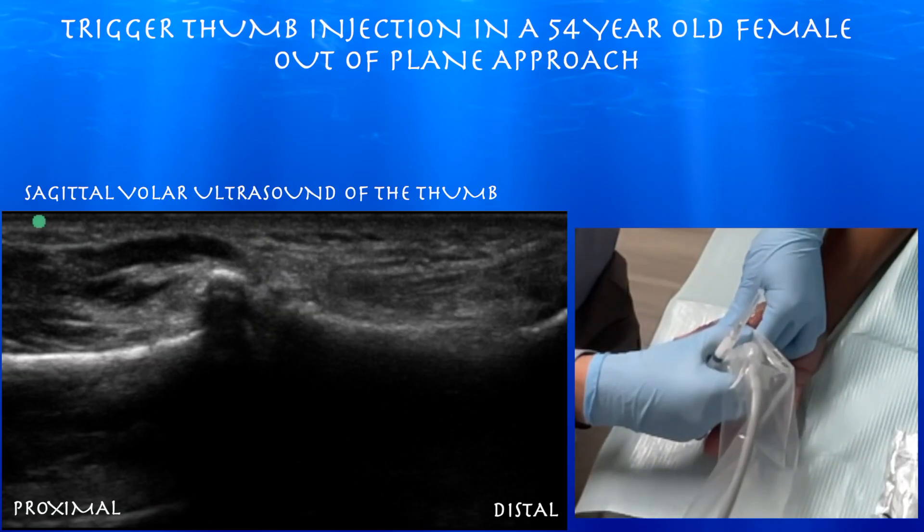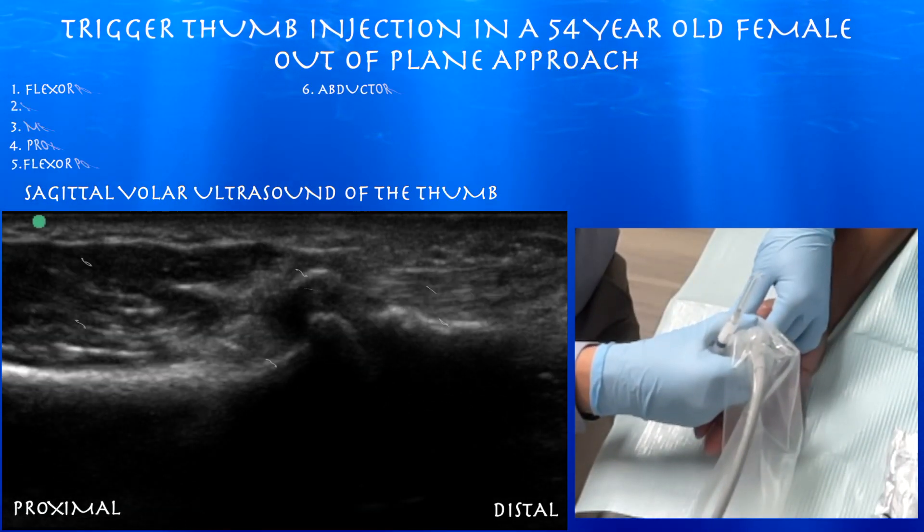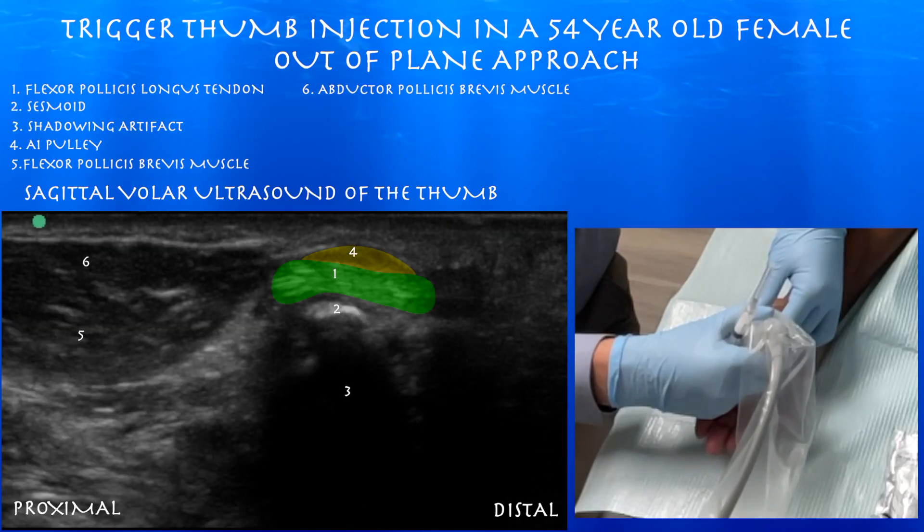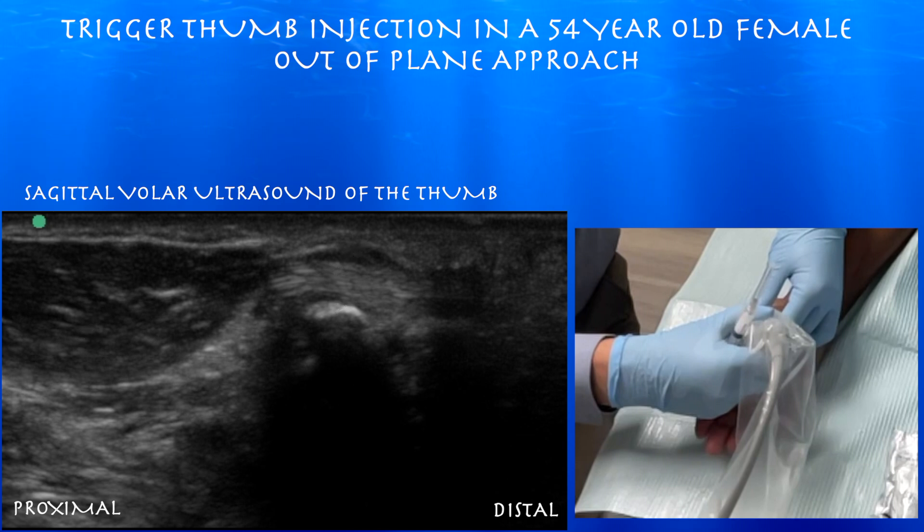Now we're going towards the MCP joint. You can appreciate a sesamoid bone, as there are sesamoid bones over that joint. You can see the flexor pollicis longus tendon rolling over the sesamoid. You can appreciate the A1 pulley above the flexor pollicis longus tendon, and the thenar musculature proximally.